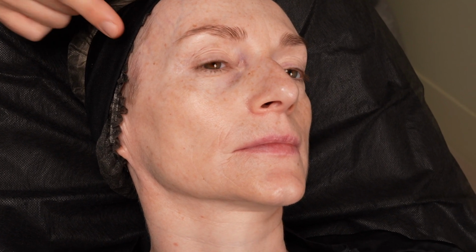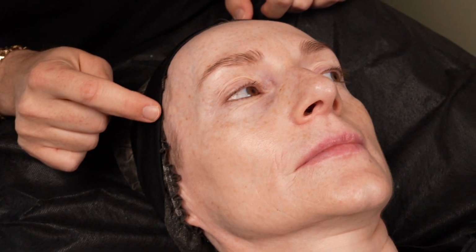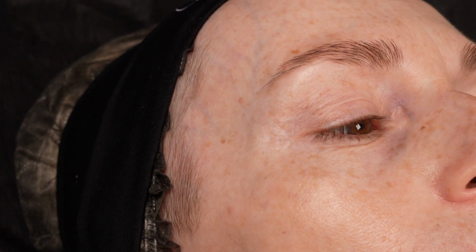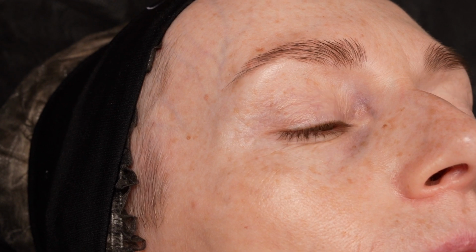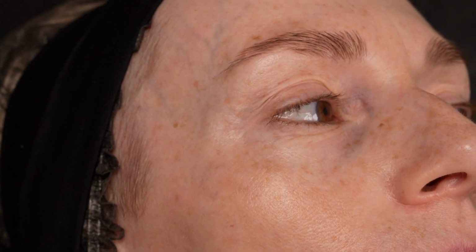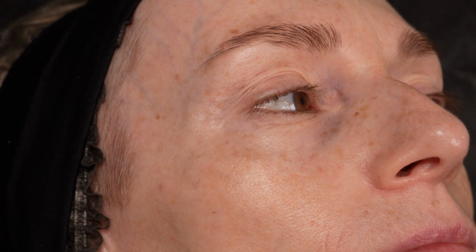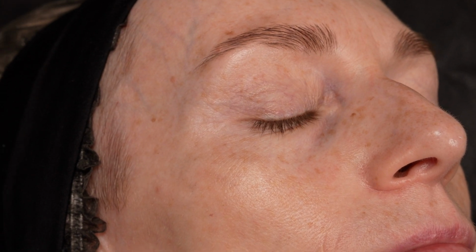We have one advantage. See everything. I can see, palpation, you see, of the artery. This is medium or large cannula? Medium. Okay, let's try. It's okay.